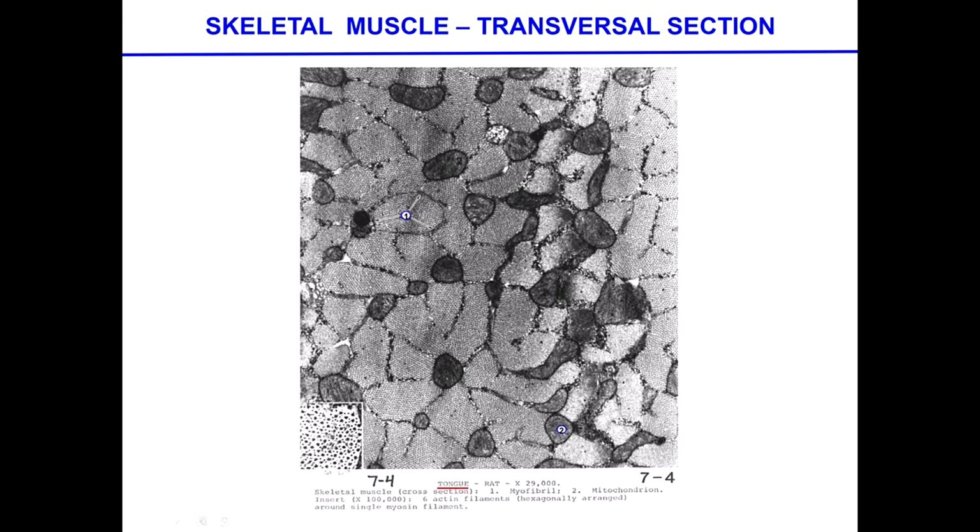All right, so this is a transversal section. And here we are seeing a beautiful example. I'm sure whoever did this slide had to spend some time looking for the perfect one, and here it is: a myosin filament and 1, 2, 3, 4, 5, 6, perfectly distributed, 6 thin filaments of actin. Right? Finding the same perfect structure in other cases is not as easy, because of the way the sectioning is done. Questions?